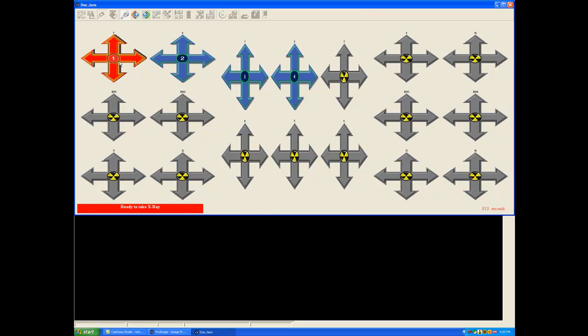you can shoot again. And as many retakes as you take, they will be stacked up on that position in the template when you're finished with this mode. But this will allow you to back up and make as many retakes until you get it right. So it's very handy because you don't have to leave this mode.